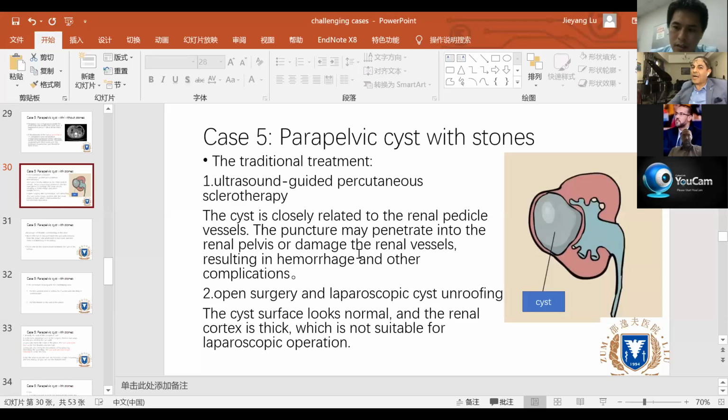So I believe the diagnosis of this case as a parapelvic cyst needs re-evaluation. It may be a closed calyx or PCL diverticulum. Do you agree? Yes, maybe, I agree with that. Yes. Anything else, Dr. Raouf?